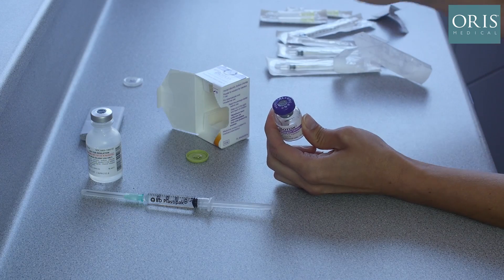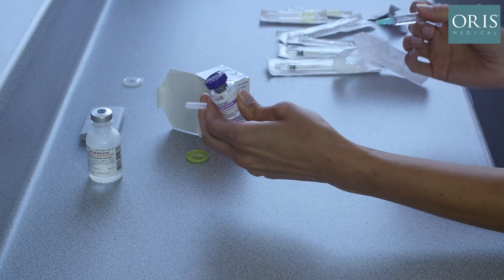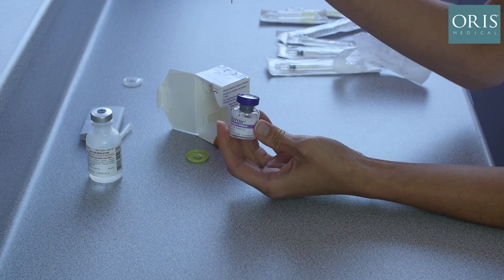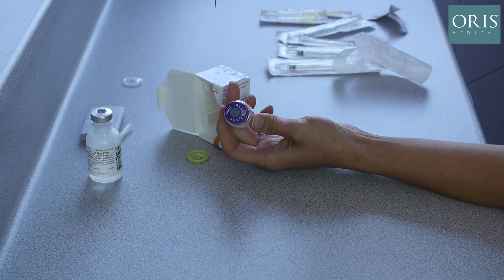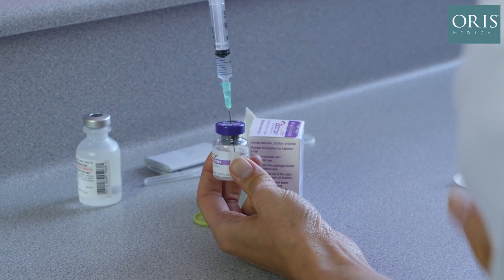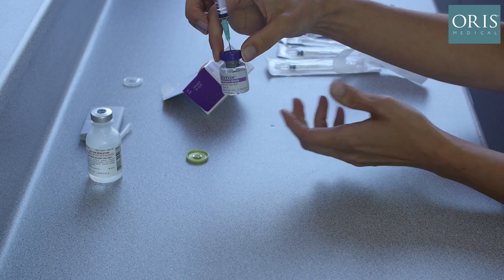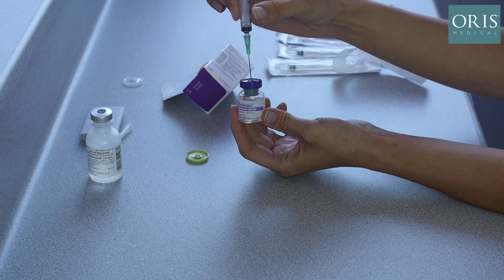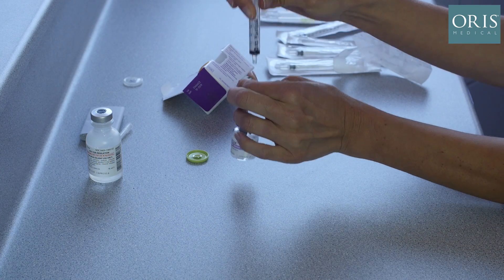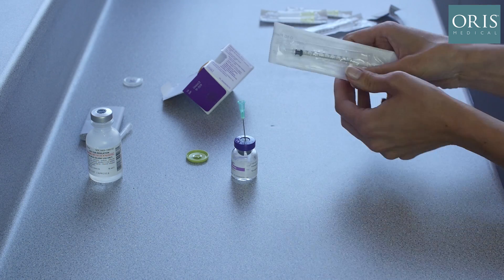We now place the 2.5 ml of bacteriostatic saline into the centre of the rubber stopper. The green needle is inserted. The liquid will automatically be pulled into the vial by the vacuum. We then gently swirl the bottle to ensure even distribution of the Botox. We remove the tip of the needle from the liquid and remove the 2.5 ml syringe, leaving the green needle in place.